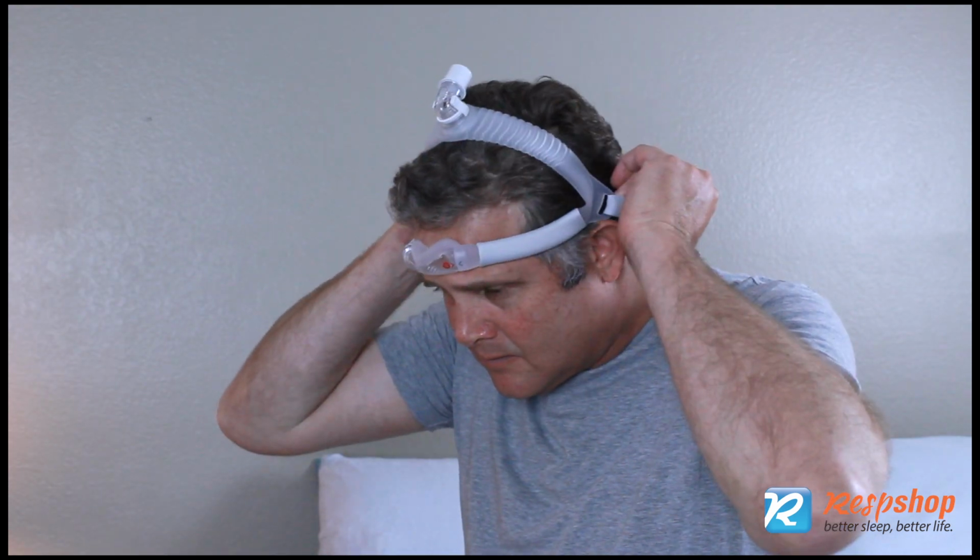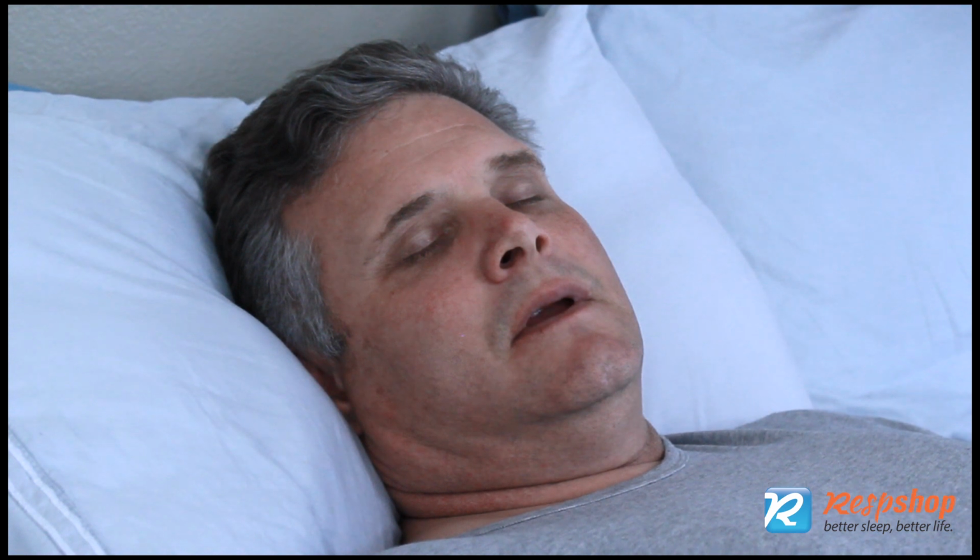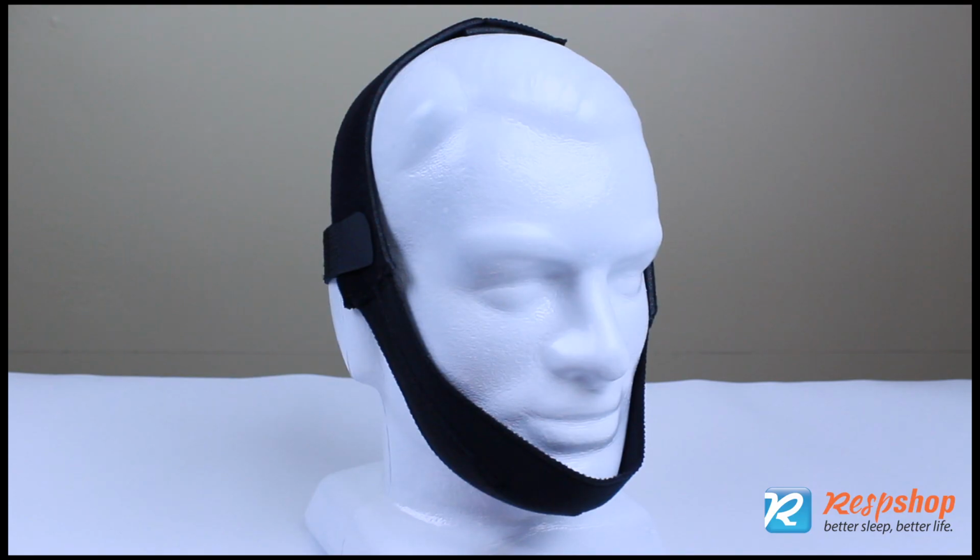If sizing is close but just not quite perfect, mask liners can help. Occasional mouth breathers who want to stick with the nasal mask can consider a chin strap.